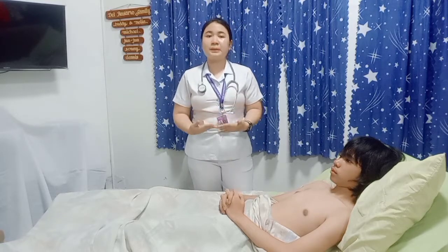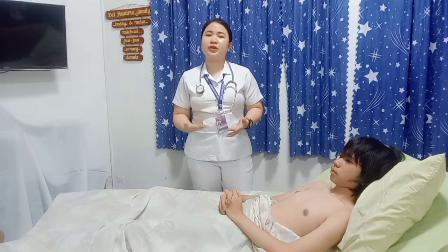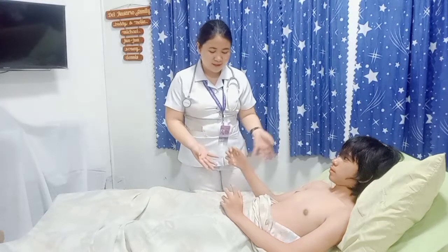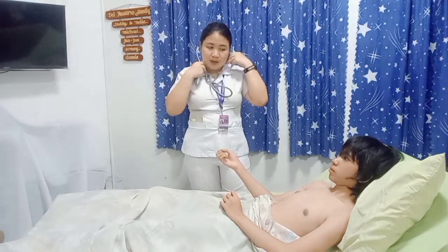However, in my case, I will be palpating the radial pulse and auscultating the apical pulse at the same time for a full minute, after which the difference between the apical and the radial pulse will indicate the result of the pulse deficit. May I have your hand, please? So I am going to palpate for your radial pulse, and at the same time, I will be auscultating your apical pulse, okay?